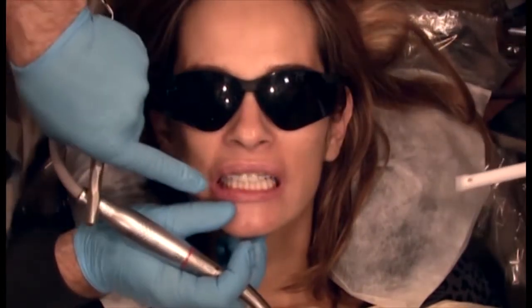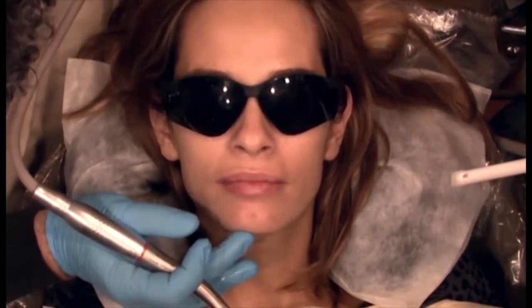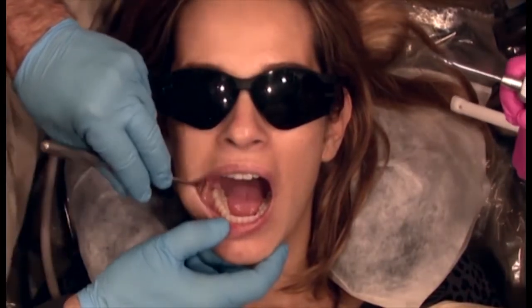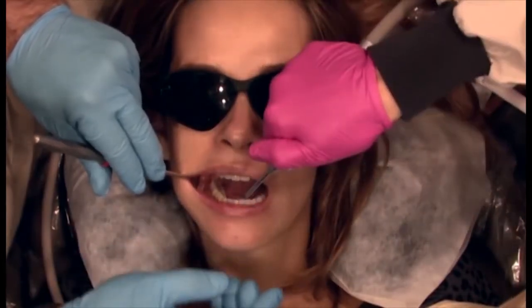Now close, you should be really close. Can you touch any teeth in the back? If you squeeze, can you touch any teeth in the back? Not yet. So one of the things, it looked to me like the patient can actually get fairly close to her teeth. Kate, let me have the thick articulating paper.